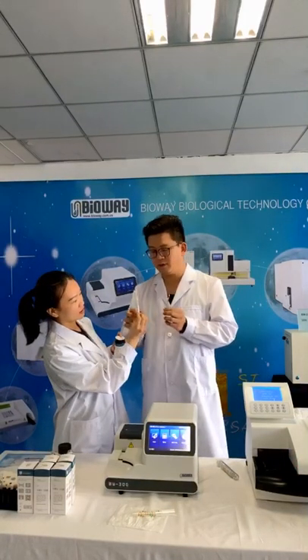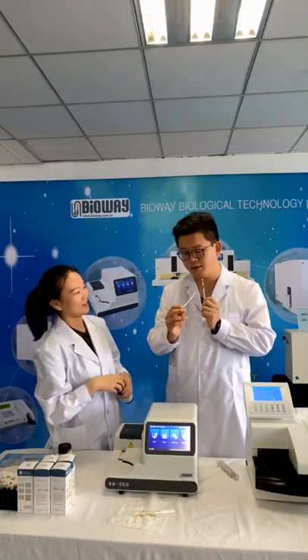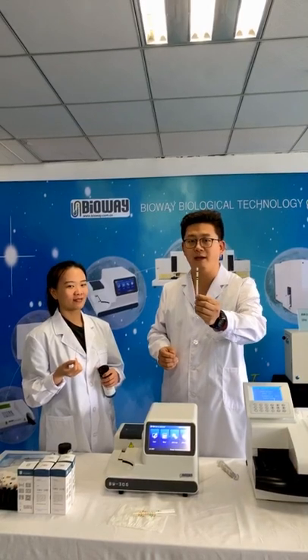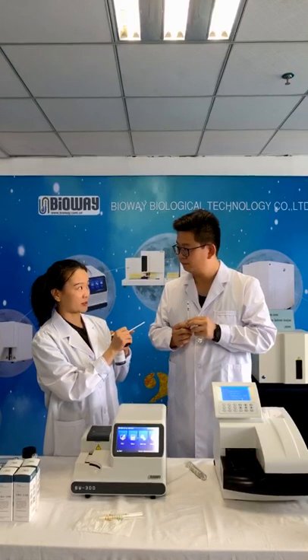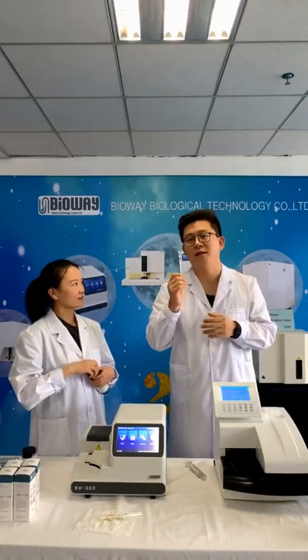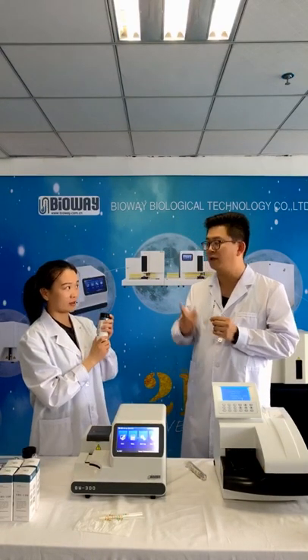This has two colors. For the real urine test strips, they are colorful, in different colors because of the recipe of the reagents. It looks beautiful, like a rainbow bar, right? Yes. And this basically contains black and white and green. The test pads are green, white, and black. So this is not a real urine strip. Yes, you're right. It's not for testing the patient's health, but for testing whether the device is accurate and running well. Oh, this is for machines and this is for samples. Yes.